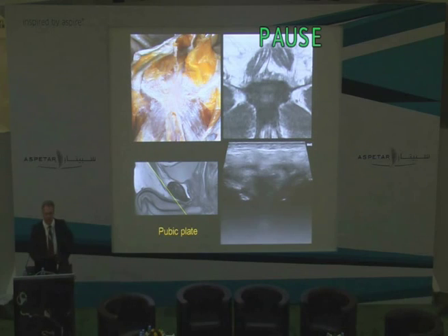Now, returning to this structure that I was talking about, this zone of altered signal that we do resolve routinely on proton density weighted MRI within the central substance of the anterior pubic ligament. If we take this coronal plane of section down through that zone, this is what it looks like. And this zone of altered central signal is that middle layer of the anterior pubic ligament.